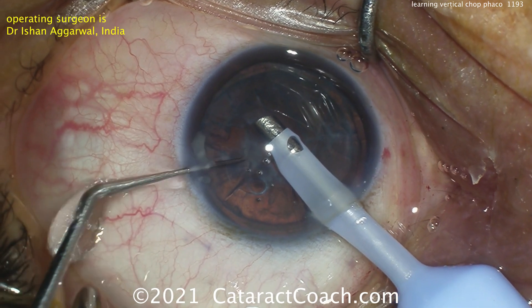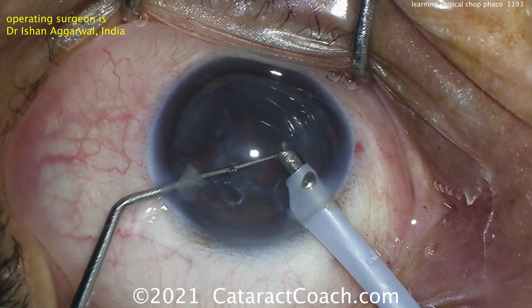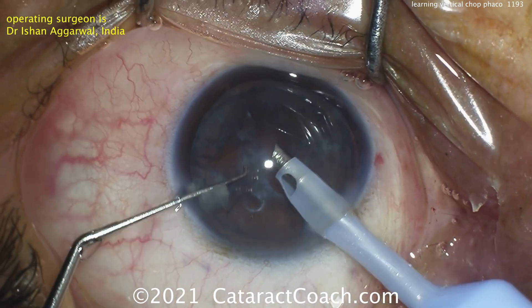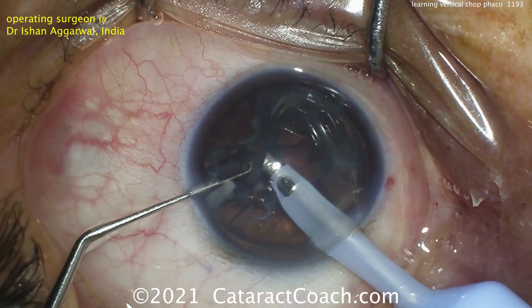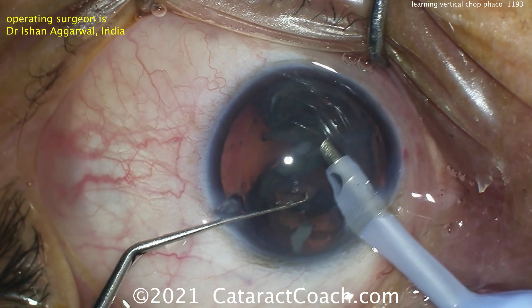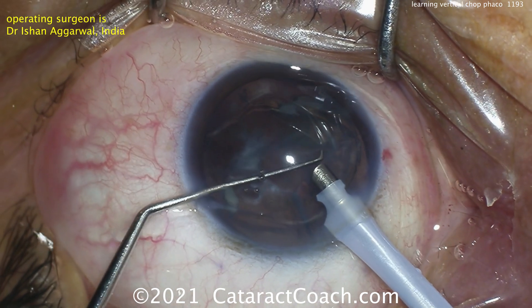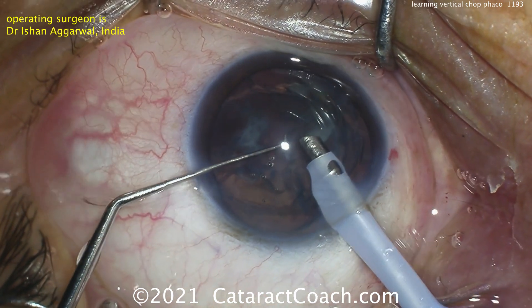That looks like a Sinsky hook or something similar — not quite as sharp. He's just going to help free that up. I just use low vacuum here and then try to tease the whole epinuclear shell out at once, sometimes even using the probe to flip it. The second instrument can be used to help flip that thing and get it out of the capsular bag. The key here is using only vacuum — don't use phaco energy. That epinuclear shell is too soft; if you use phaco energy, you'll lose your grip and go right through the piece.